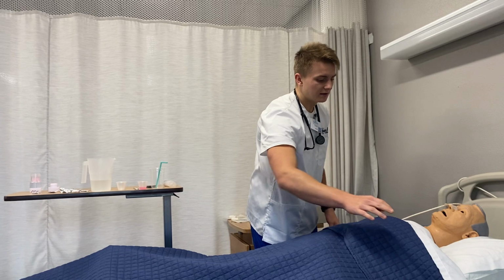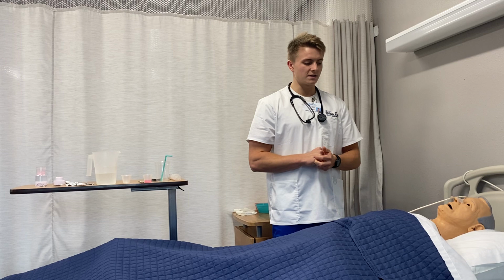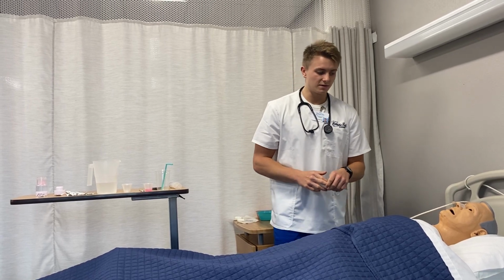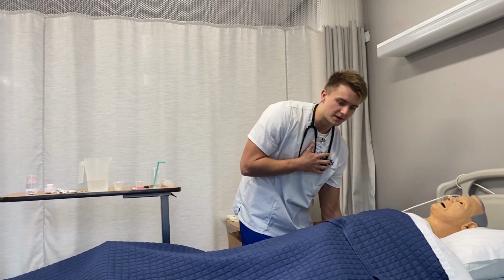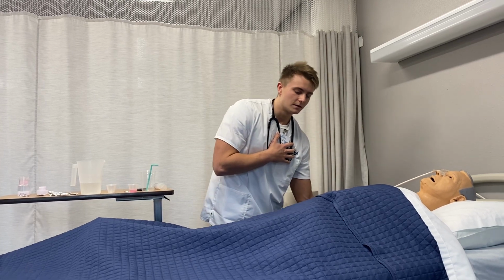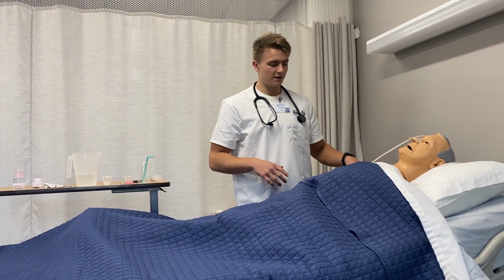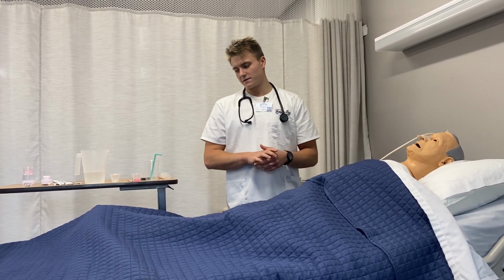Today, what we are going to be doing is medication administration for nasogastric. We're going to put some medication through your feeding tube here. Jim already has a feeding tube, and so I'm going to demonstrate what would happen if he didn't have one. So I'm going to make sure that the bed's in working height for me, and that Jim is leaned forward. Now we can't go all the way forward for this because we have a makeshift stomach, and so we would have him a lot higher than this, but we're not going to have him that high for this demonstration.